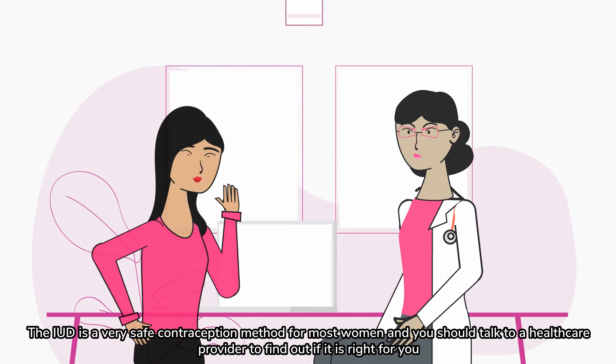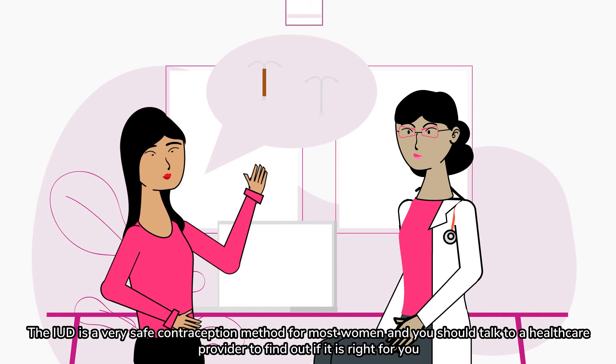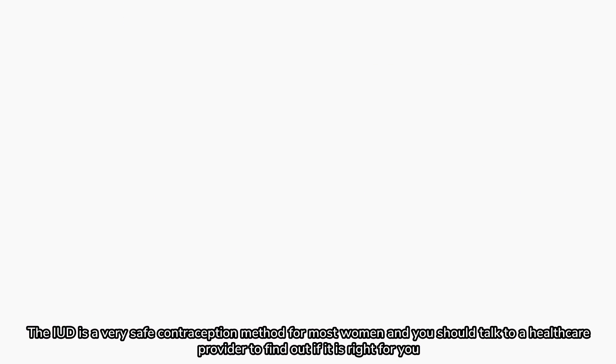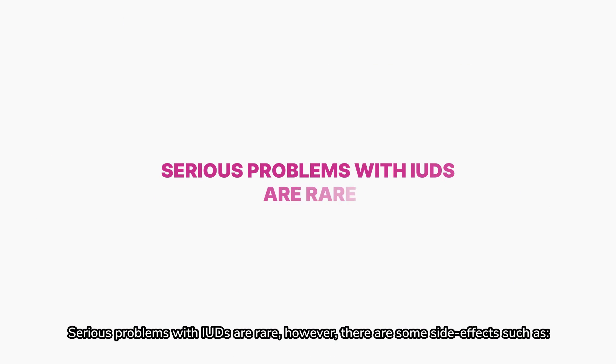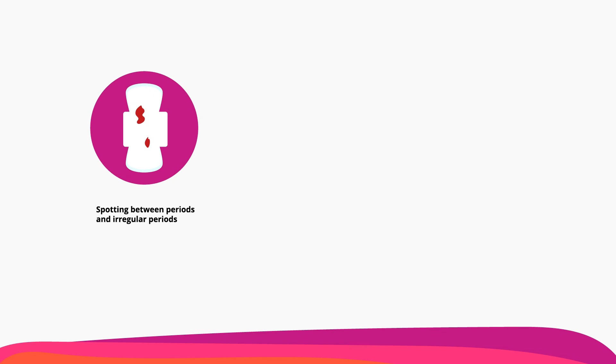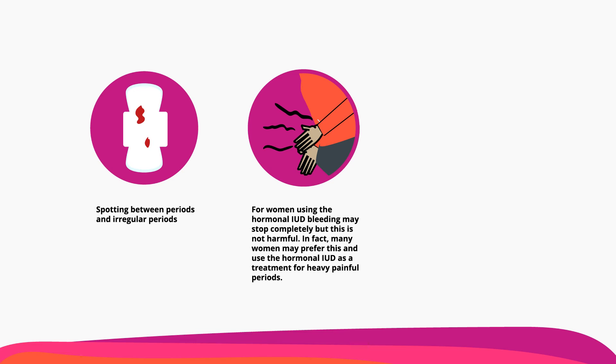The IUD is a very safe contraception method for most women, and you should talk to a healthcare provider to find out if it's right for you. Serious problems with IUDs are rare. However, there are some side effects such as spotting between periods and irregular periods. For women using the hormonal IUD, bleeding may stop completely, but this is not harmful. In fact, many women may prefer this and use the hormonal IUD as a treatment for heavy, painful periods.